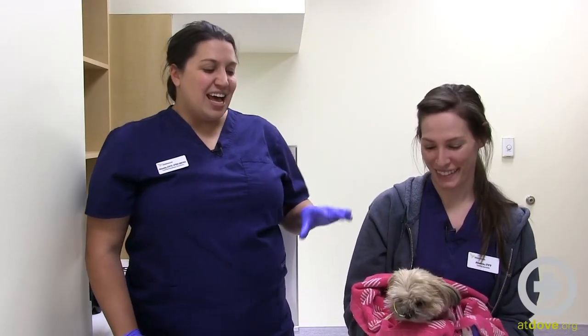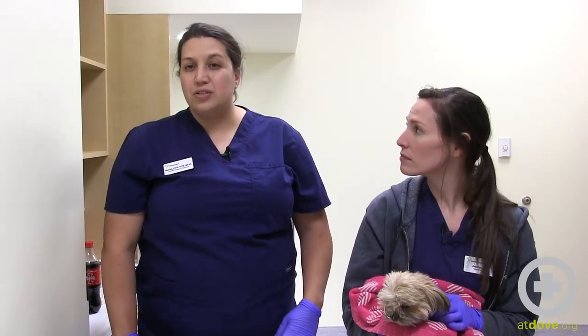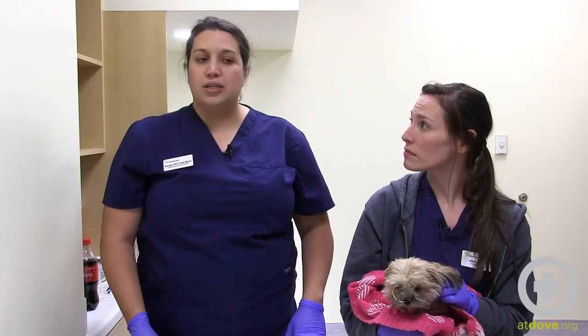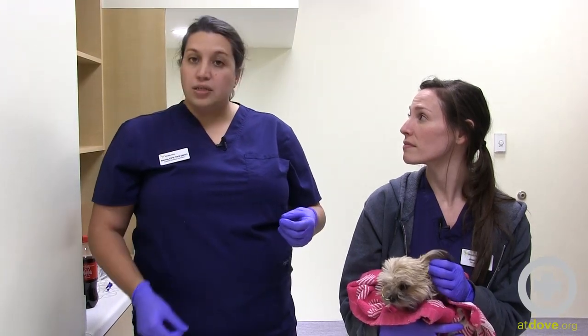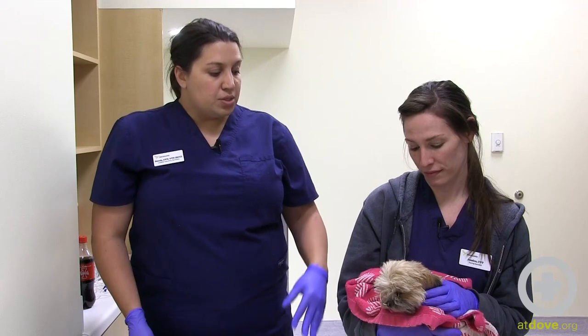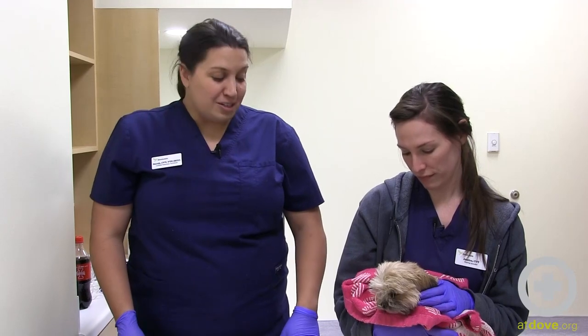Hi, my name is Sarah, this is Jess, and this is Leah. We're going to talk to you today about unclogging feeding tubes. Feeding tubes are used in critical care medicine very frequently as a way to give medications and get nutrition to our patients. They're really effective and simple to use, but sometimes we run into problems with medications or mucus getting clogged in the tube. When these tubes clog, it can be really problematic — if you're unable to get them unclogged, they need to be replaced. Technicians that are used to using these have some tips on how to get them unclogged.